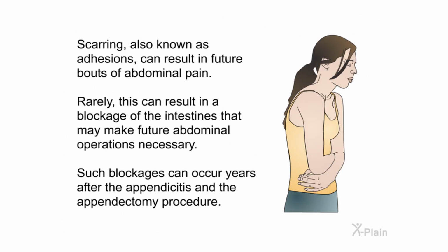Scarring, also known as adhesions, can result in future bouts of abdominal pain. Rarely this can result in a blockage of the intestines that may make future abdominal operations necessary. Such blockages can occur years after the appendicitis and the appendectomy procedure.